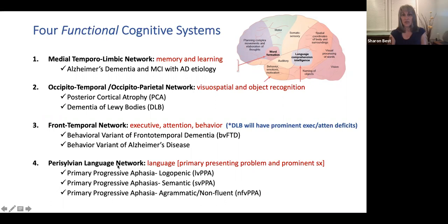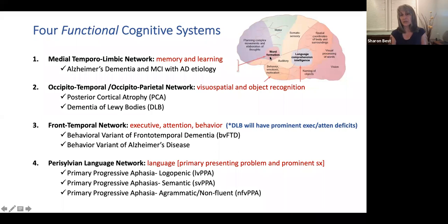Finally, we have the perisylvian language network — around the sylvian fissure dividing the temporal lobe from the frontal and parietal lobes. The logopenic PPA is generally superior temporal and posterior parietal; the semantic variant PPA is generally anterior polar temporal atrophy; and the agrammatic is often in the inferior lateral frontal area.